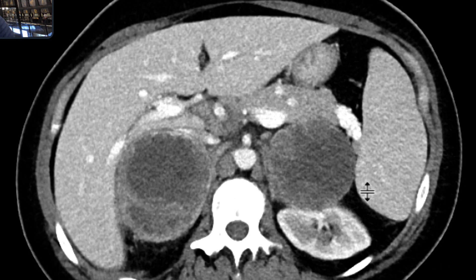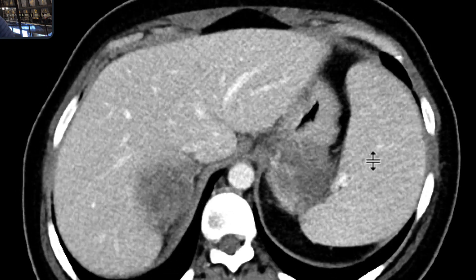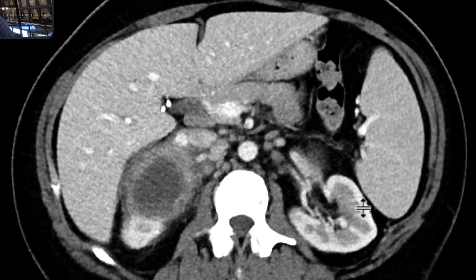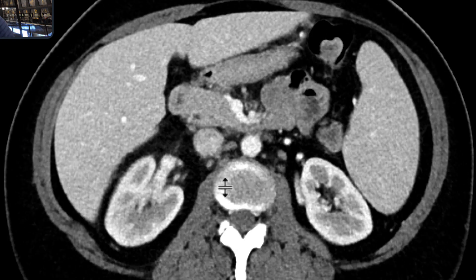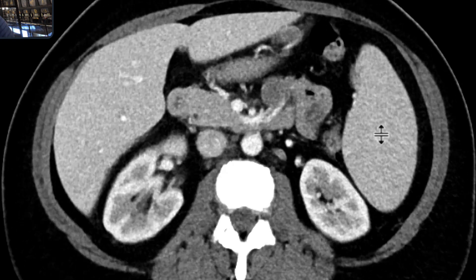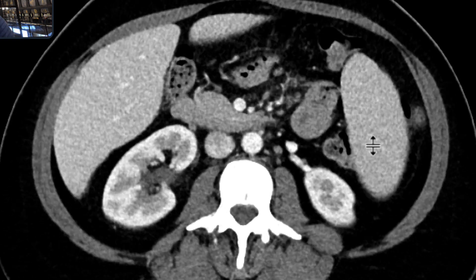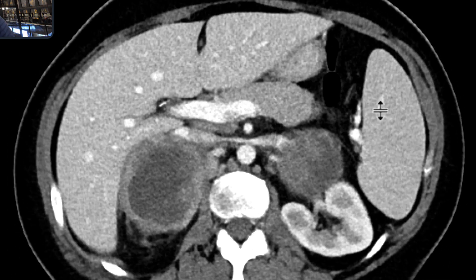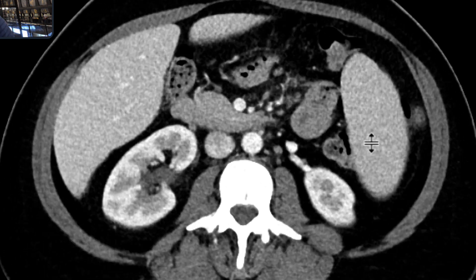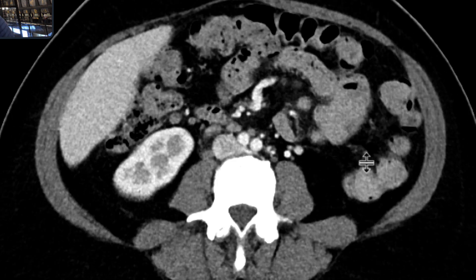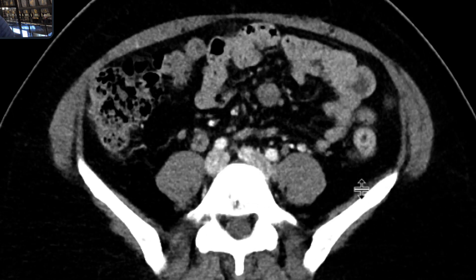There are bilateral adrenal metastases as well — these large masses. There's a lot of adenopathy as well as you scroll down. Some of these nodes are sub-centimeter, but they look prominent and a little heterogeneous.